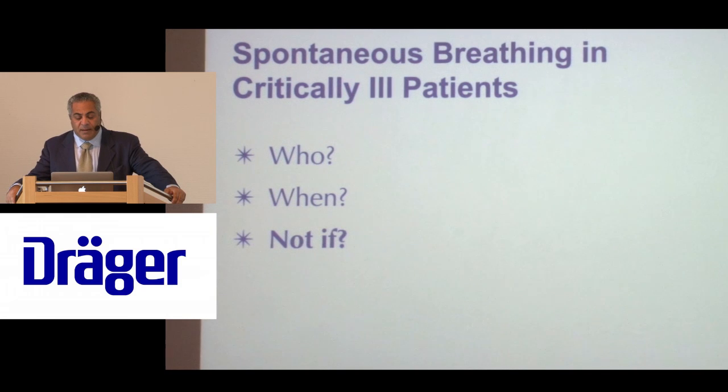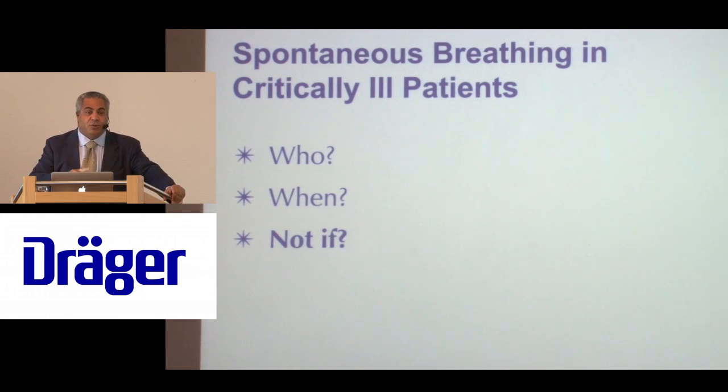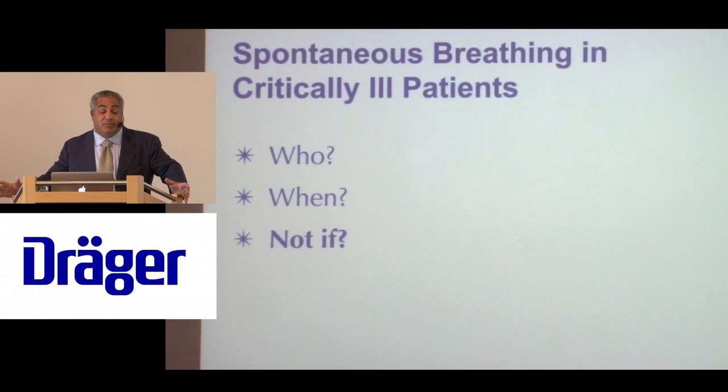So, in my mind, our patients absolutely need to breathe. There's no way around it. If you ever want to extubate your patient, you have no choice. If the patient never resumes the ability to breathe independently, you will remain on the ventilator. So in my mind, it's not whether they should or shouldn't. It's really when should they do it, and is it better to do it early or late? And I think that's not an easy question to answer, because it depends on the patient.